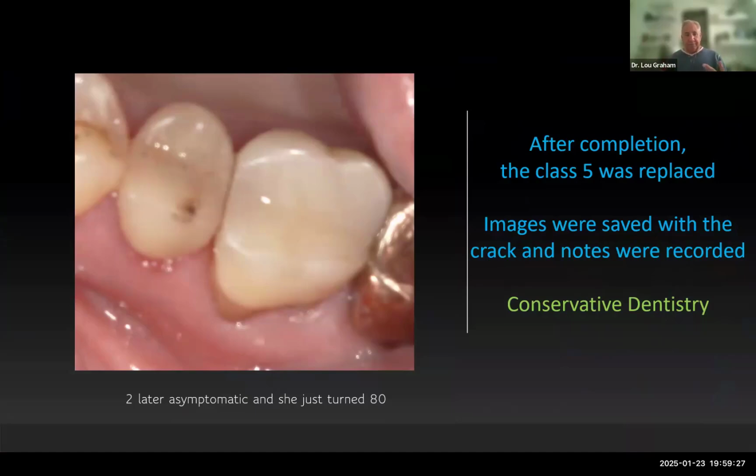Now, if you think about it, I used SDF, obviously, to cleanse it, obviously remineralize it long-term, and then this was my approach to a glass ionomer, then etching and bonding and placing my final composite. And I wish this picture wasn't blurry, but you don't see that white, like little, I call it that little white marginal.